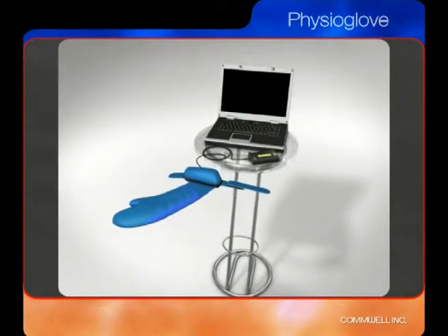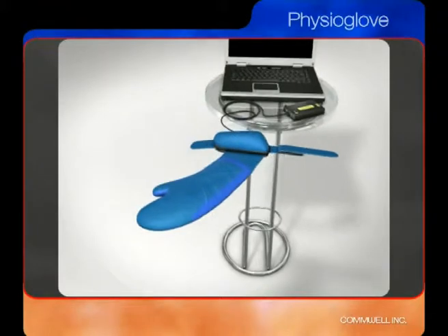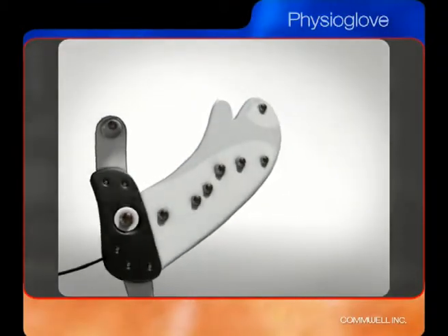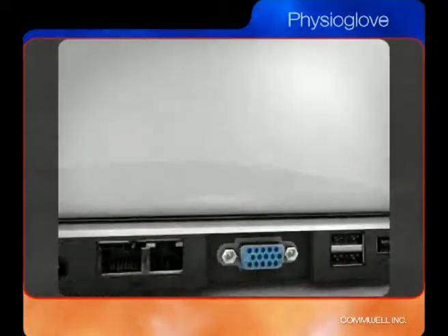Now, Comwell is revolutionizing the technique of performing 12-lead ECG with its Physioglove platform. The Physioglove, although capable of doing much more, is in its most basic form, in essence, a sophisticated replacement for the conventional 12-lead ECG cable.